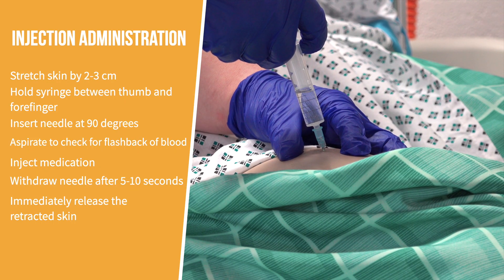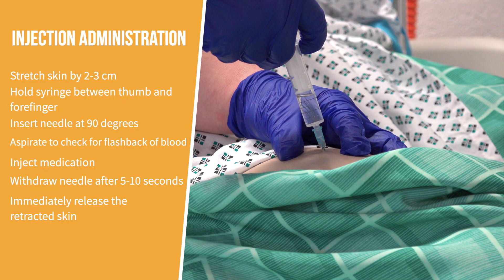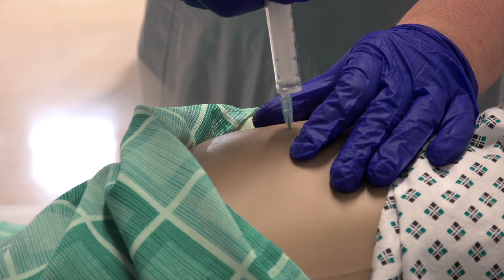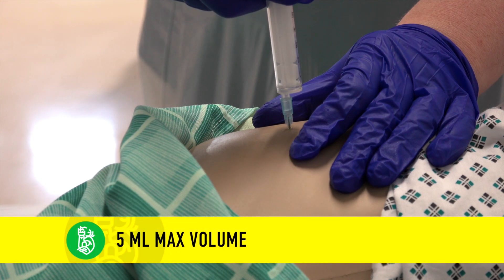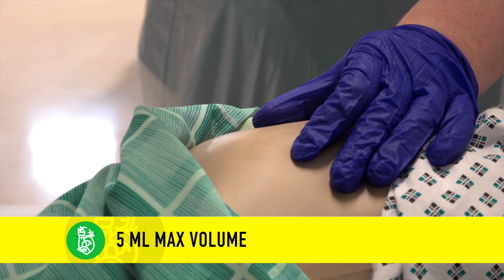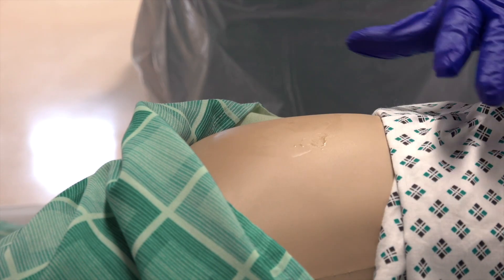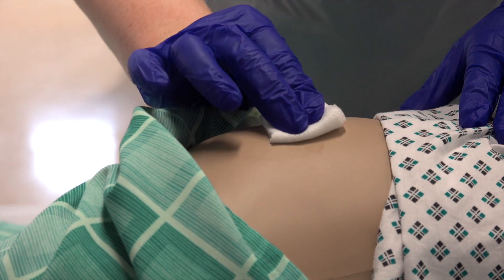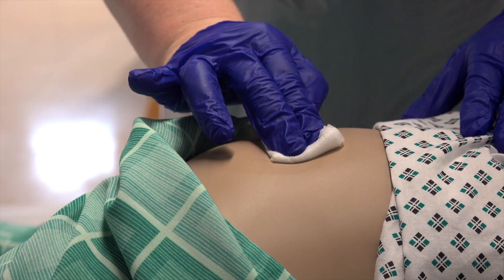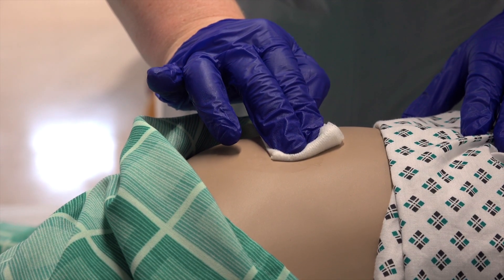If blood appears in the syringe, immediately withdraw the needle, discard it safely, prepare a new syringe, and repeat the procedure at a different site. Inject slowly at one millilitre per 10 seconds. Wait 10 seconds before withdrawing the needle to allow drug dispersion, then let the skin return to normal to seal the drug in the muscle. Apply pressure to the site with dry gauze.